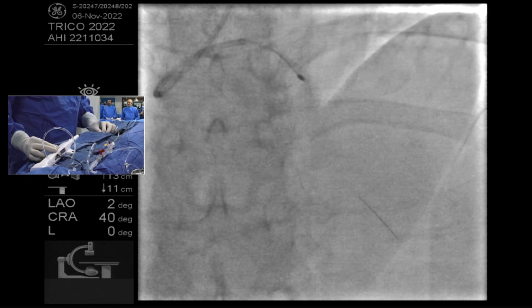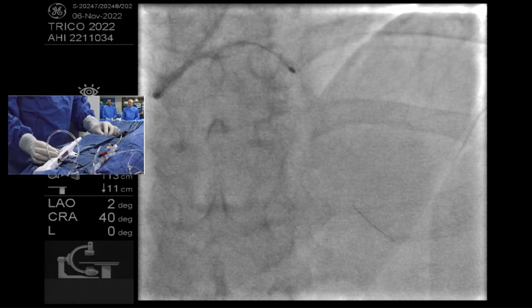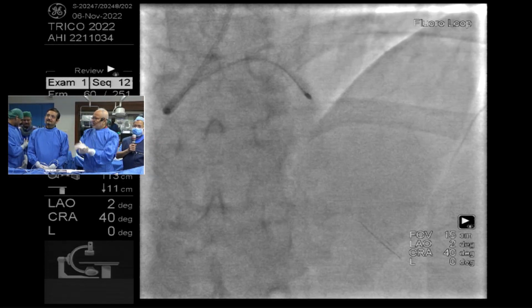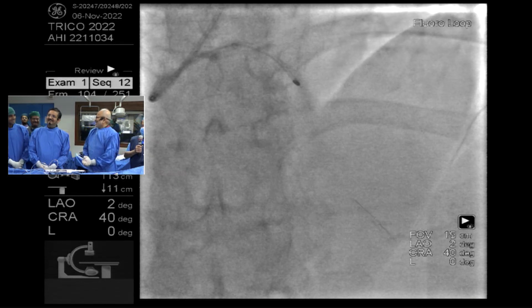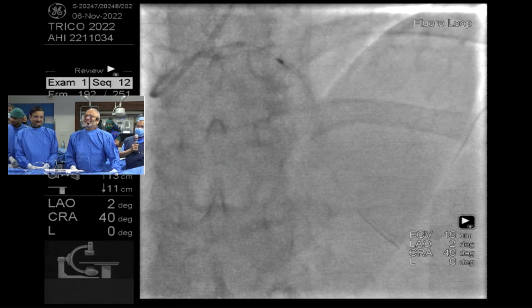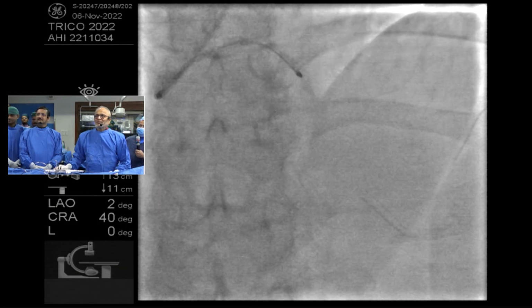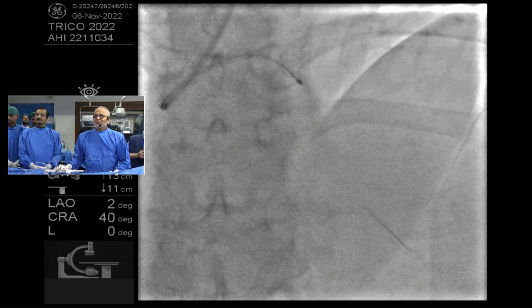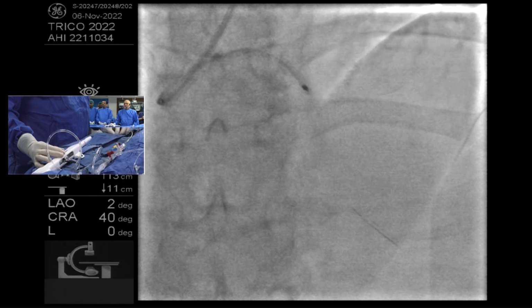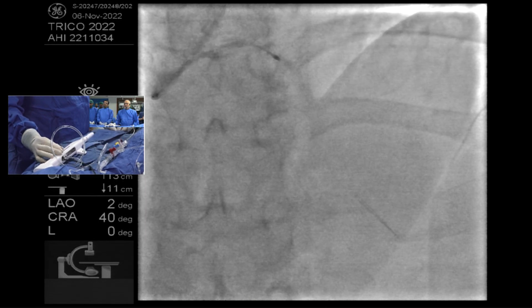I think it is moving a little bit. It'll take a few more passes. Okay, wait for some time. I don't know why the patient is so stable. That's a good part. They don't have ADHD, that's why they will benefit. But you show a very good technique. The guide is a very good support. It'll take a few passes, and you tap it. It's no rush. It's making progress, little by little.